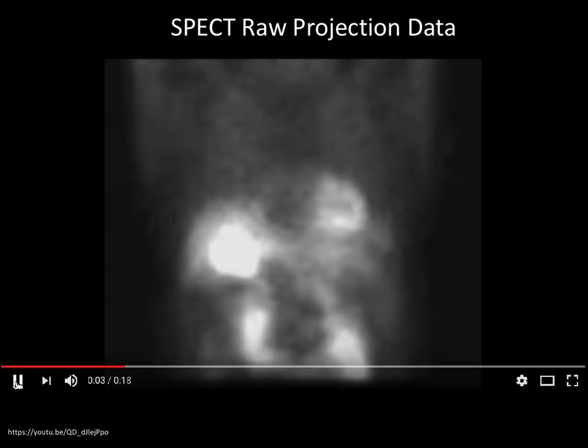So in cancer, if you do a picture like this, and the whole field of view looks pretty uniform, like a normal thing, usually they use a different agent, then you're good. If, on the other hand, you just see bright dots in the field of view, where these mets have accumulated this agent, you're not good. And at that point, many times you don't really care if you can image the spatial resolution very well. It's just a binary decision. Is it there or is it not? That's not our application.